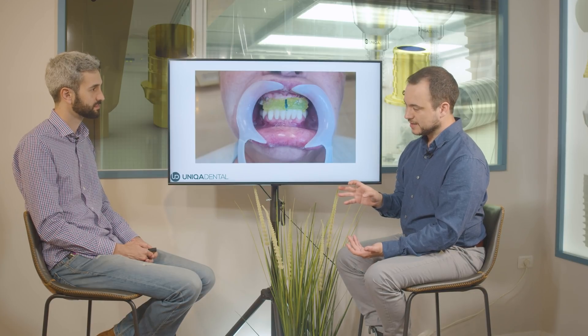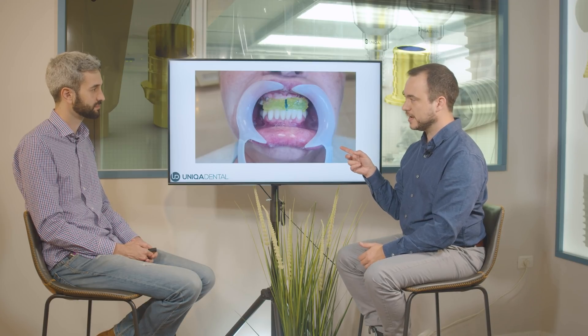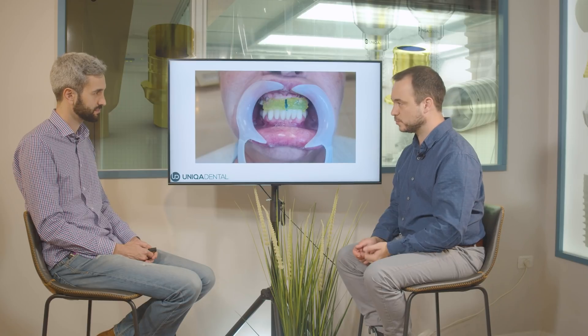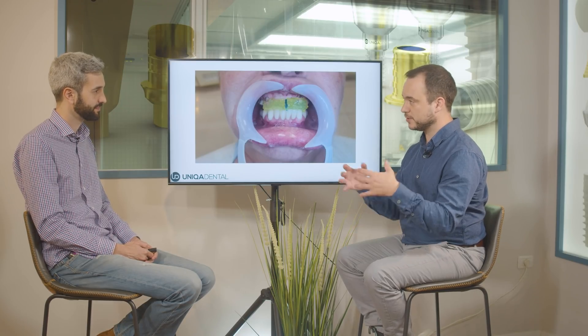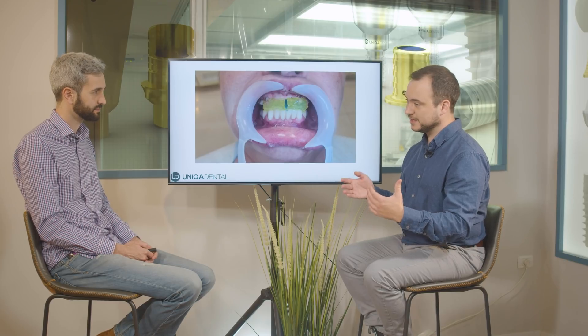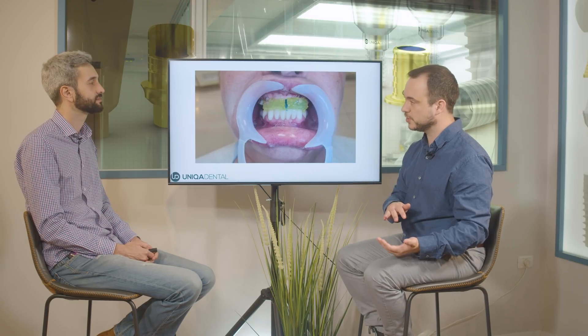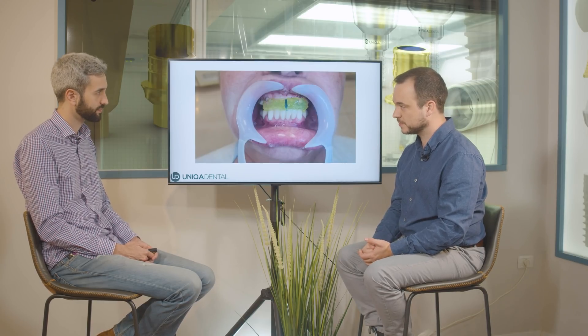We can then place the scan of this composite material — together with the palate and scan abutments — on top of the previous scan we took. That gives us the full jaw with all the scan abutments, the entire palate, and everything in relation to the lower jaw according to what we built with the composite material. Thank God for composite!